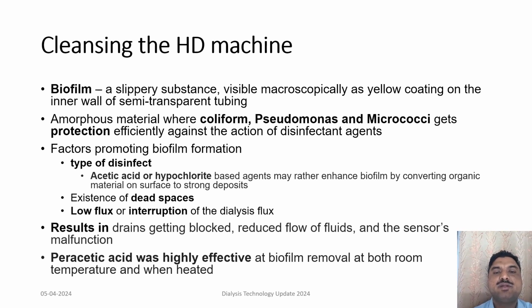The factors that promote this biofilm formation are the type of disinfectants. So as is seen, acetic acid and hypochlorite based agents, rather than killing the biofilms, may enhance the biofilm formation by converting the organic material on the surface to a strong deposit. The second factor is the existence of any dead spaces. The third important factor is the low flux or interruption in the dialysis flux. These are the factors which tend to promote the biofilm formation.